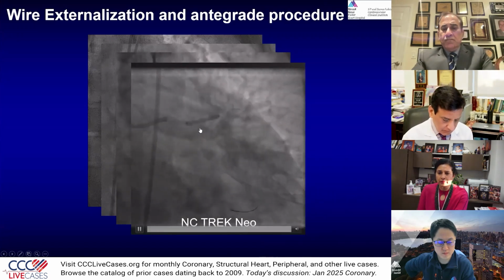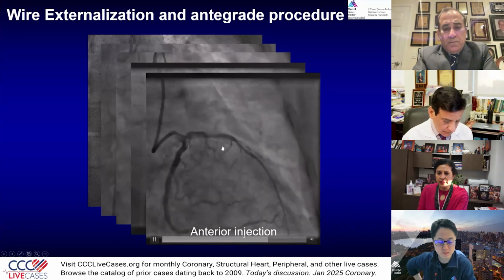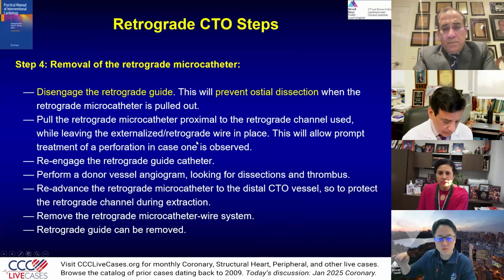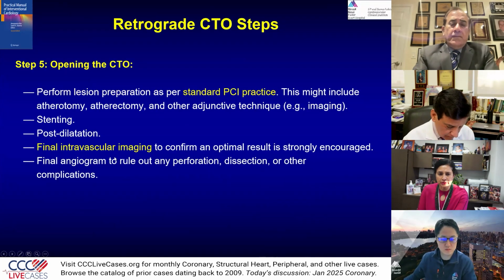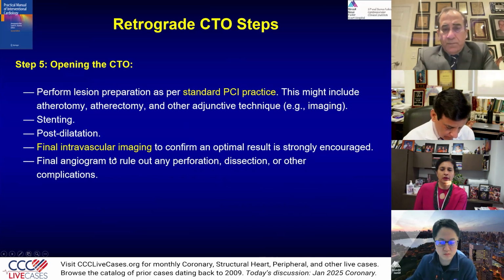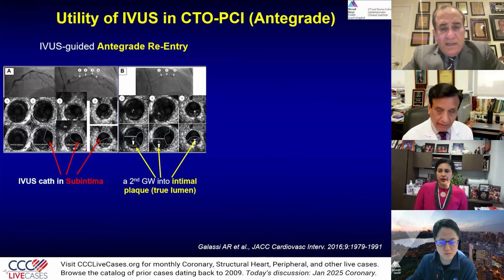Of course, then we dilated. Once we dilated, that's when we did the IVUS. These steps we went through, it is very important that you pay attention to your guide catheters. IVUS here, yeah.